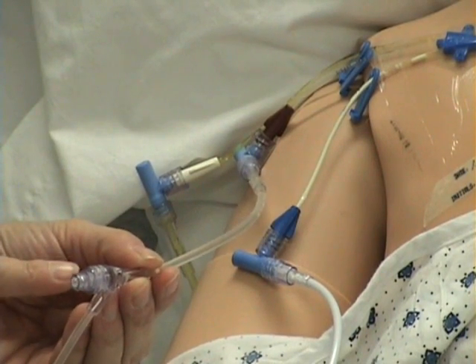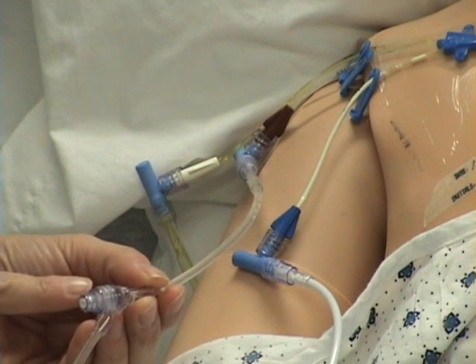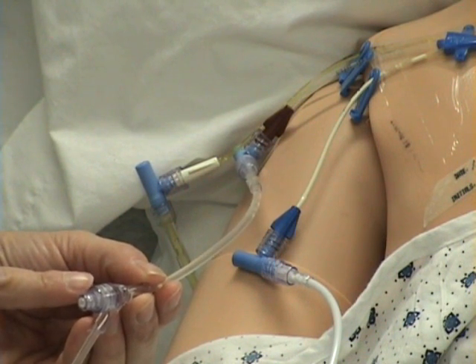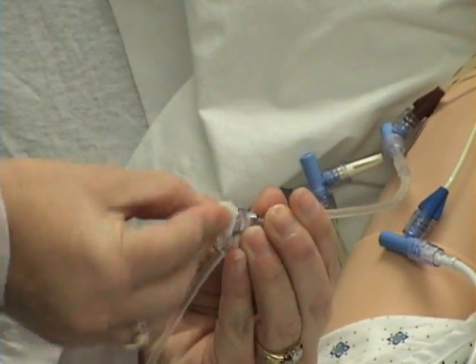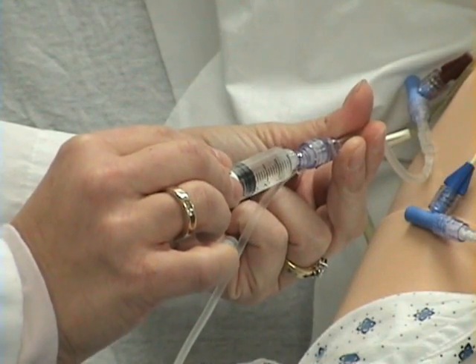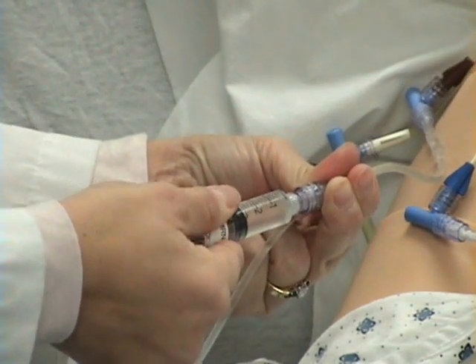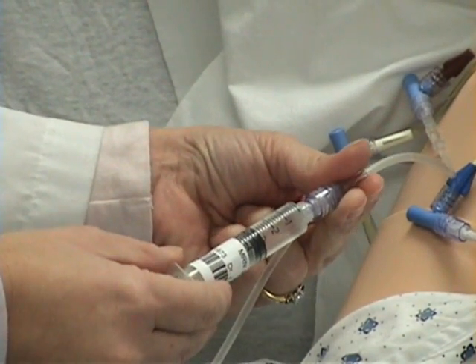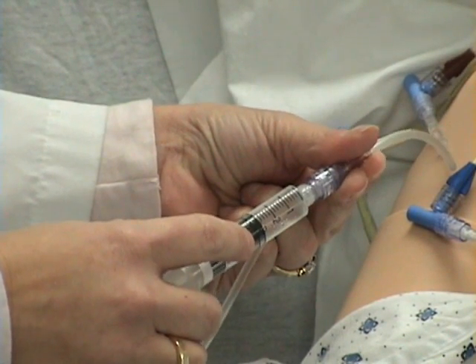I want to go to the port on the normal saline line that is closest to the patient when administering an IV Push medication. I am scrubbing the port with an alcohol prep. I will connect the syringe to the port in a twisting motion. For a complete demonstration on IV Push medications, see the IV Push medications video.